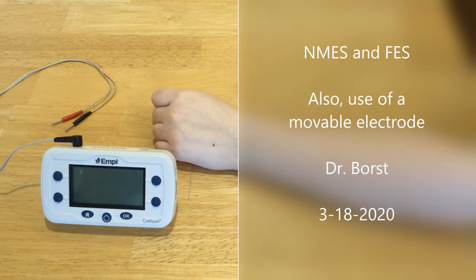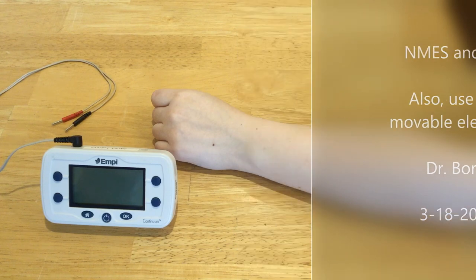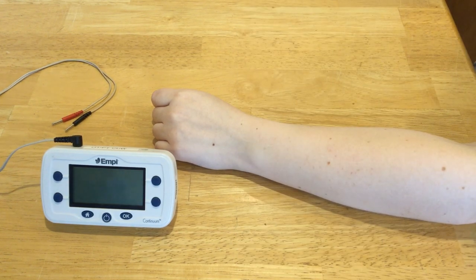In this video I'm going to demonstrate application of NMES, or neuromuscular electrical stimulation, using an Empi Continuum unit.